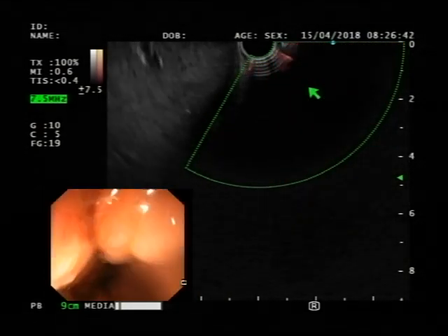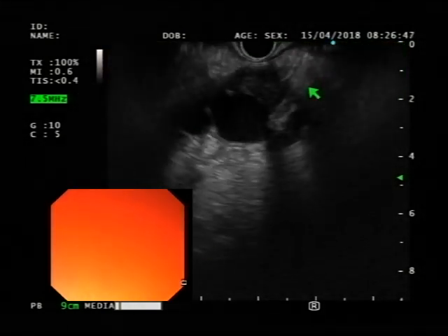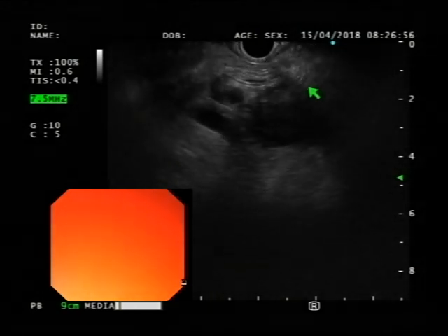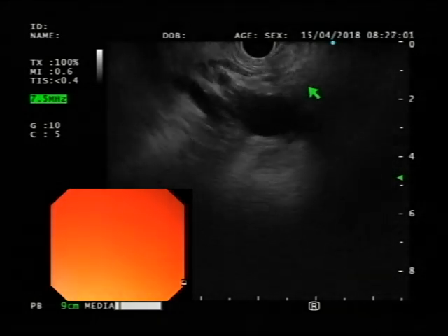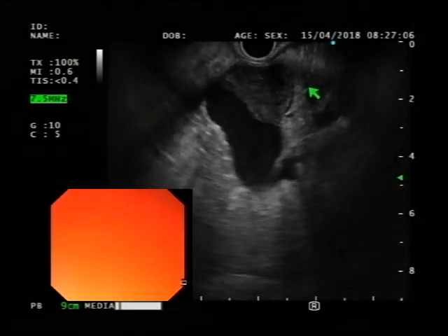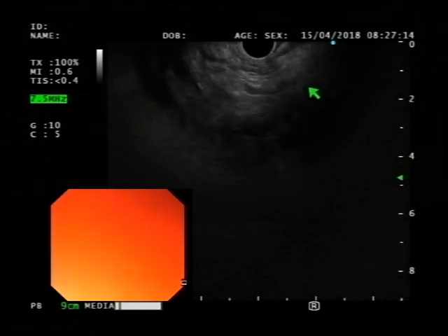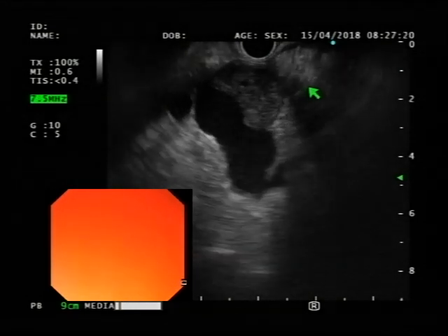Khalid, this is Mustafa here. Can you just show us the clot? When you were going clockwise towards the body, if you just go clockwise to where you would expect the body to be, just take a look there. So here it is. You see that clot right there? Yes, clearly a clot. As you pull back a bit and go clockwise, right there. Keep going. Nothing there. And that's still there. That's clearly a clot.